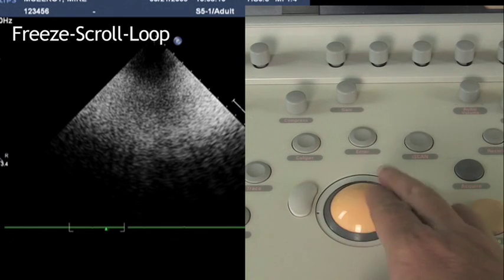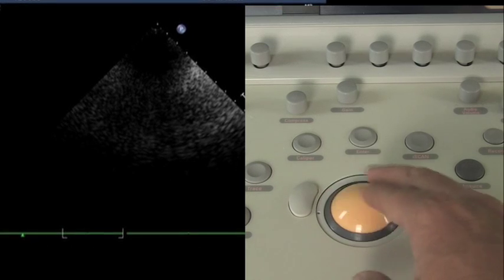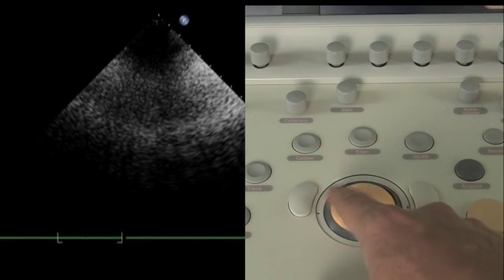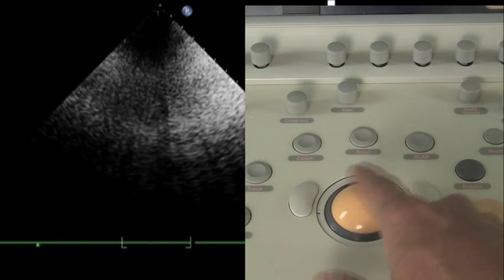We just scroll right through, and you'll see in the bottom of the screen where we can scroll. And also on the bottom of the screen there is an F number, which is frame number. So we have over 500 frames stored here.